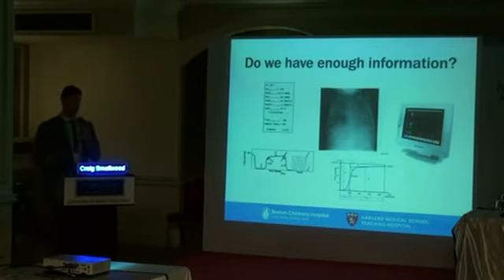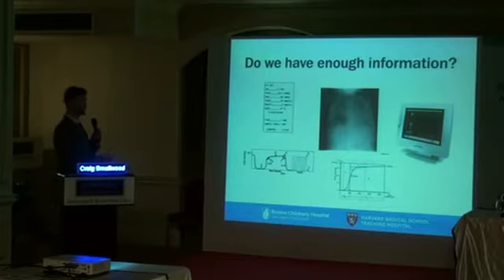So do we have enough information right now? Why do we even need EIT or an extra device? So this is typically what we'll see. We get blood gases. I like this one because it's just a nice little paper printout if you have one of those portable devices, but oftentimes it goes to a central lab.